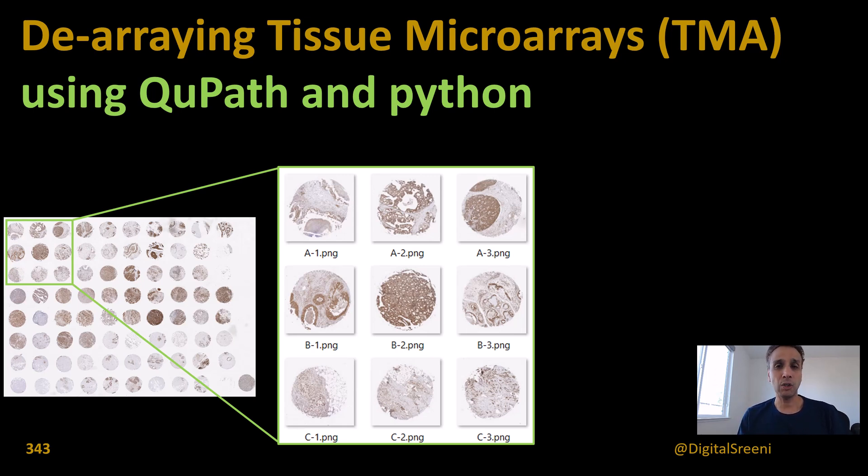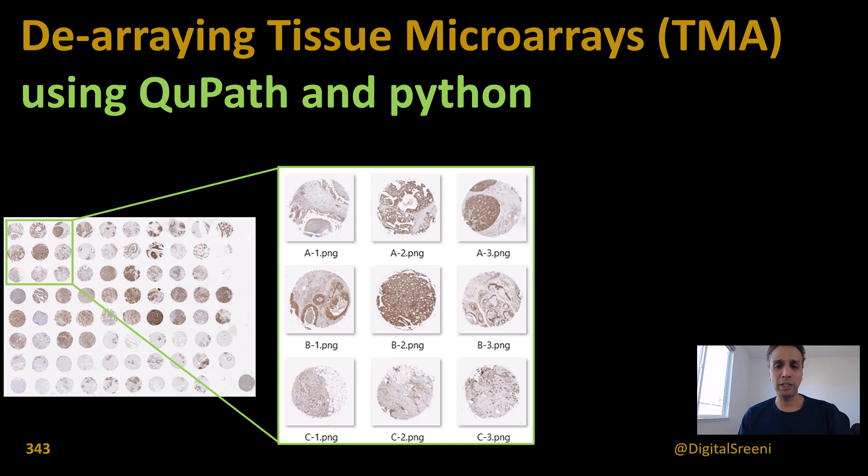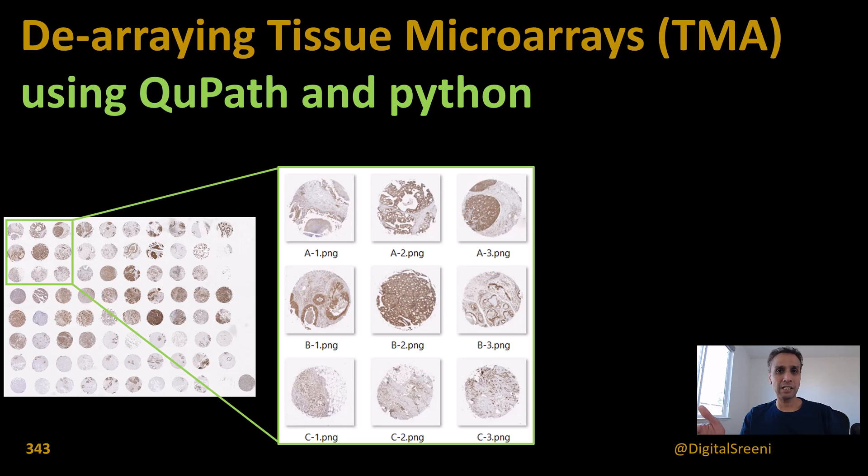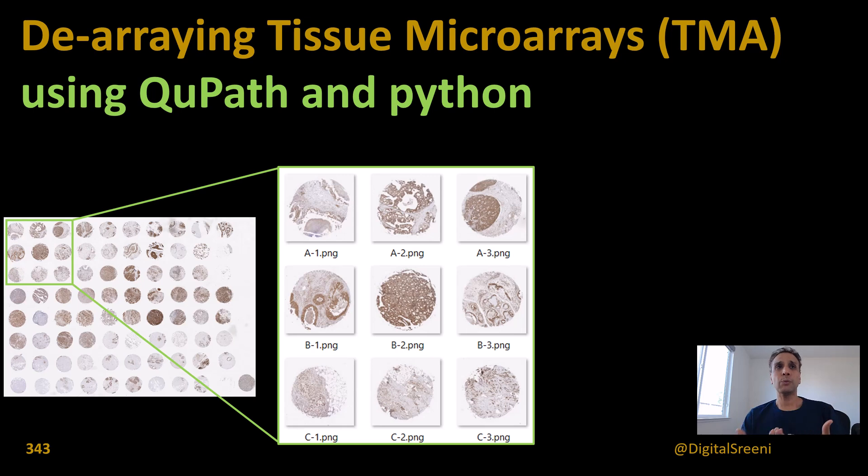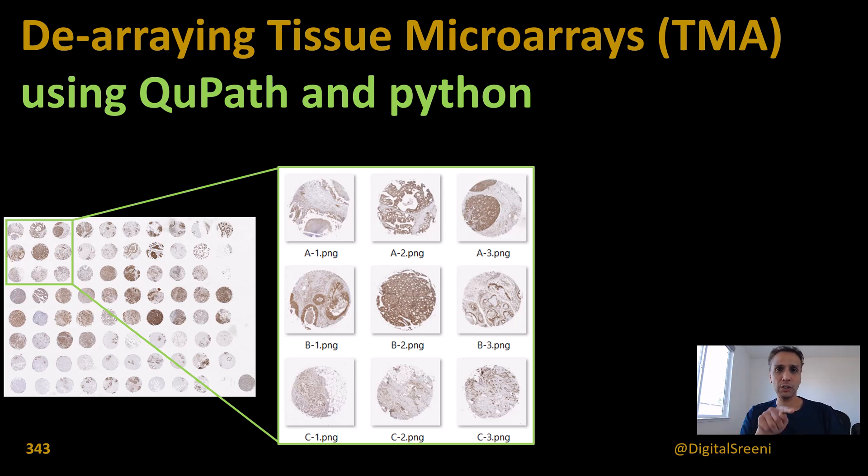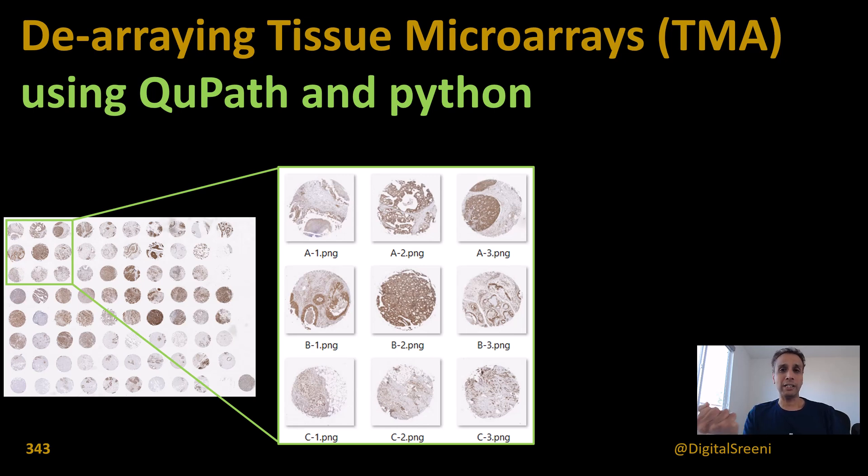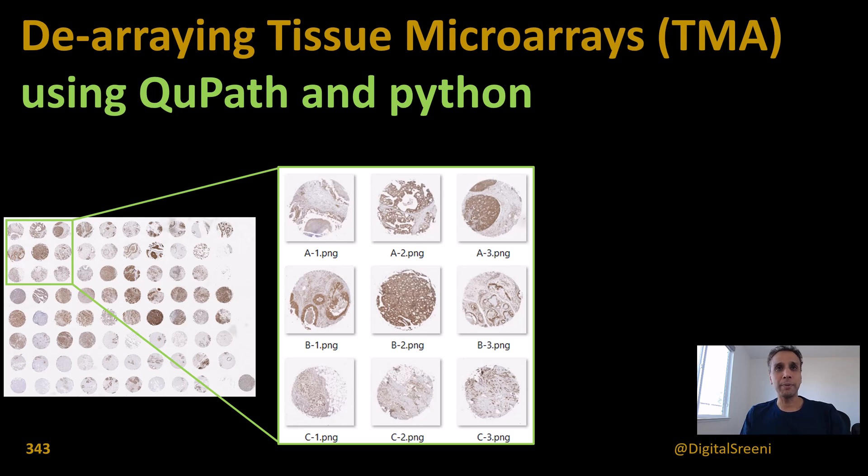You may ask why not just use QuPath for everything? Well, it may not have all the tools you need for customized analysis. Python gives you much more flexibility if you work with individual high-resolution cores. I'll first use QuPath to identify the locations of these cores, download the locations as a text file, and use that as input to extract these cores.